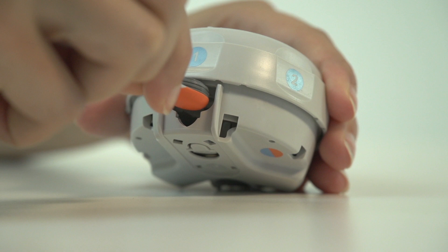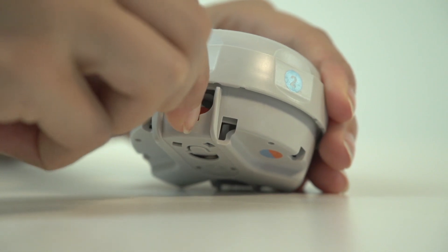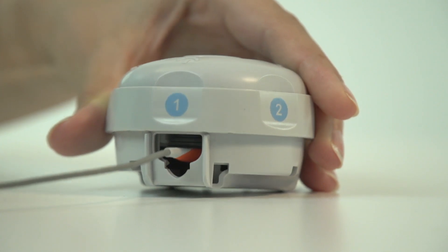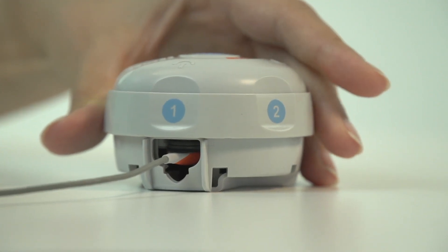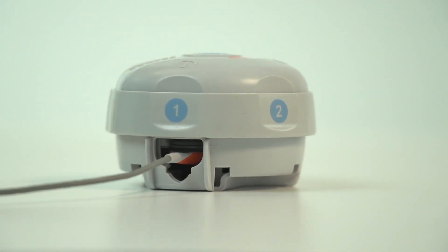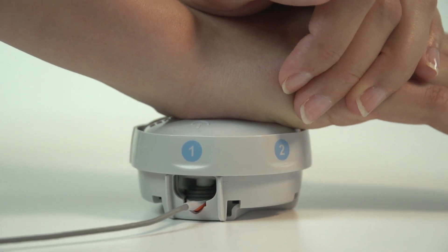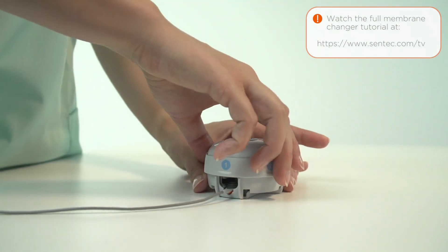Once the sensor is dry, you will need to replace the membrane. Carefully insert the sensor into the membrane changer without touching the exposed sensor surface. Make sure the sensor is aligned correctly. Proceed with the membrane change as usual with the alternating pressing and turning steps.